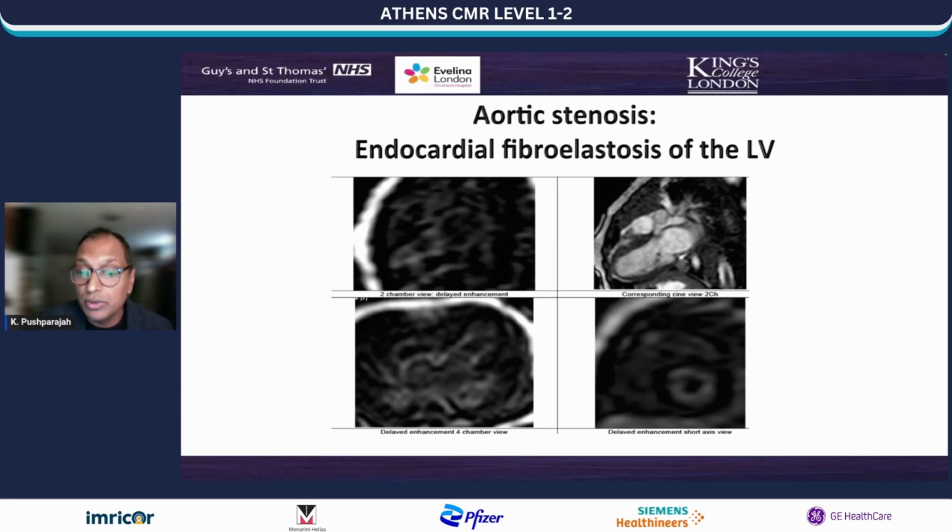Of course, in patients who have the Shone type complex, where you can have a constellation of left heart issues, here you can see there's endocardial fibroelastosis in the bottom right-hand corner with that circular lesion of late gadolinium enhancement, explaining the elevation in the left ventricular end diastolic pressure, elevated left atrial pressure, and thereby giving you post-capillary elevation in pulmonary artery pressures.